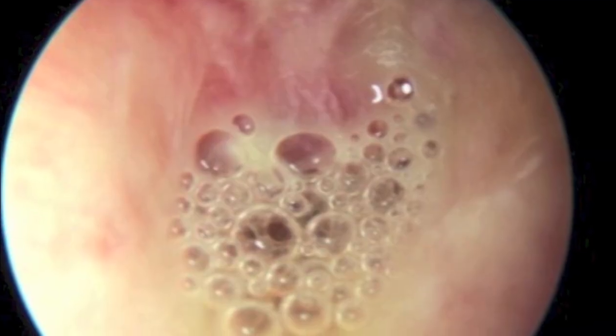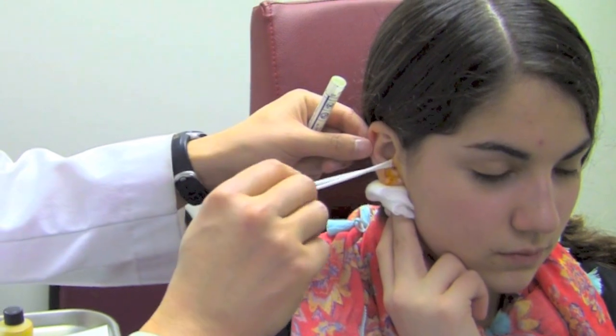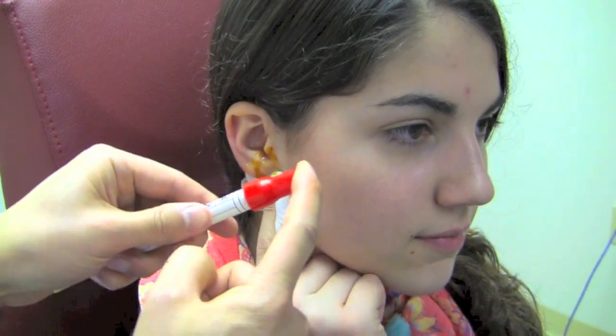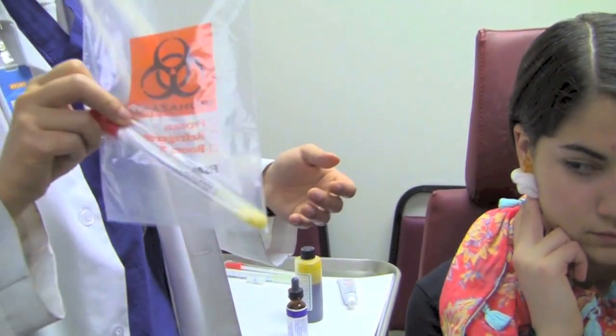In this example, we have a patient with a severe ear infection with pus that has been coming out of her right ear for the past few weeks. This has not responded to antibiotics. A culture is obtained of the pus that is coming out of the ear with a Q-tip swab. This is placed in a tube for transport.